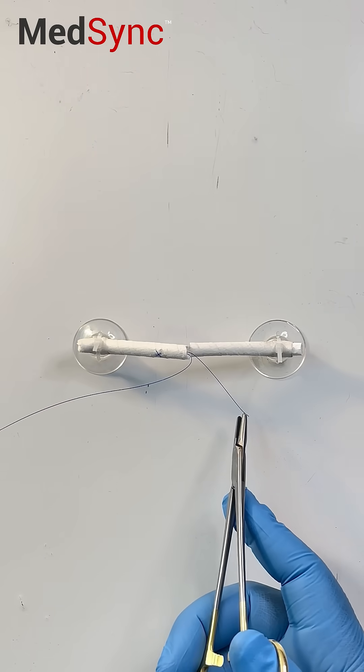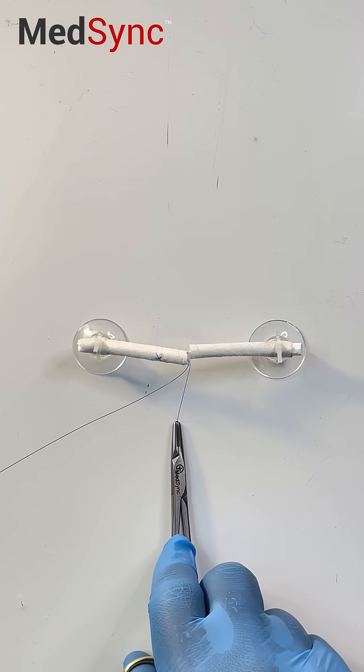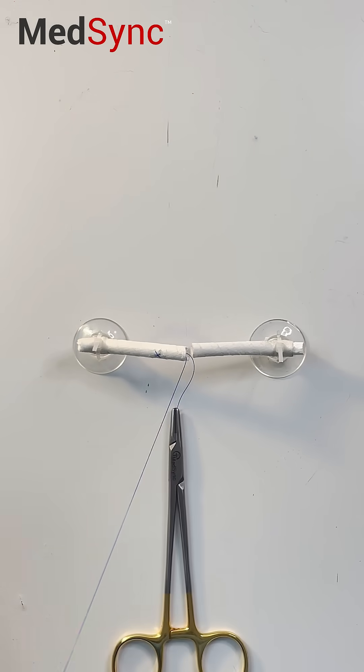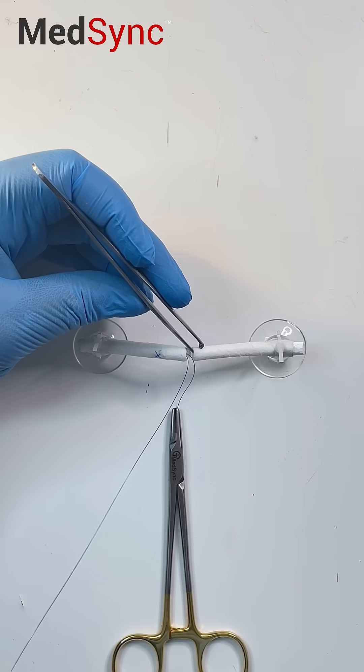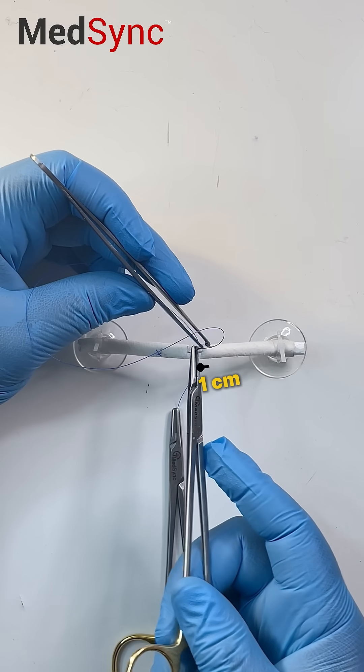Place a clip on the end of the short suture to keep it out of the way. On the opposite side we start the same way with a one centimeter bite, but the end is different.